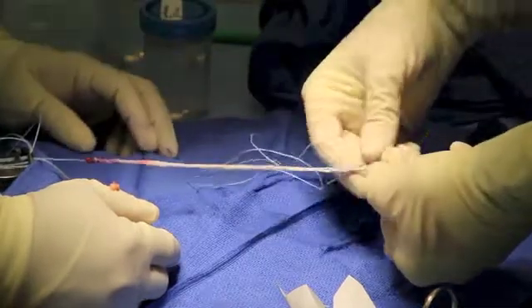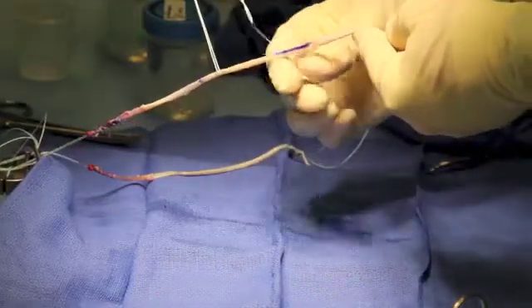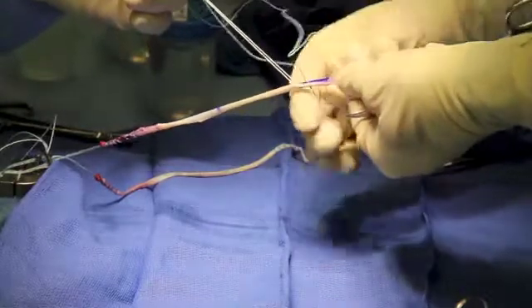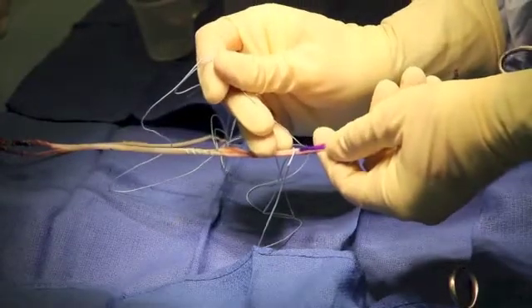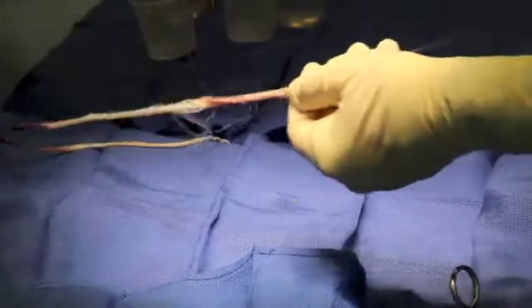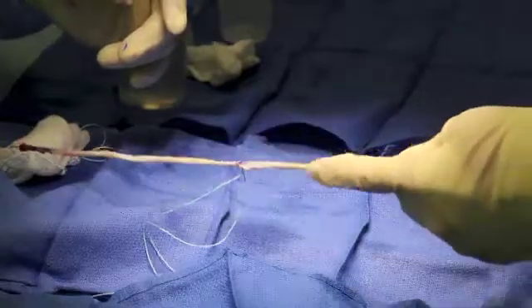Next, the semitendinosus is whip stitched at its mid-substance fold. We whip stitch 2 cm upstream from the second fold, ending just above the fold to allow for some graft to creep. Finally, the free end of the semitendinosus is whip stitched, starting 2 cm upstream and finishing 1.5 cm downstream from the third fold. The additional 1.5 cm of whip stitching allows for this fiber loop to be secured to itself at the end.